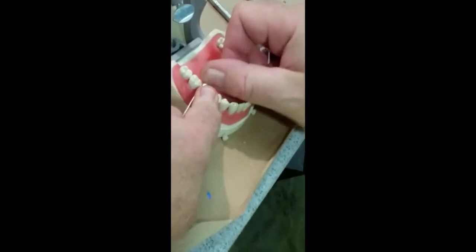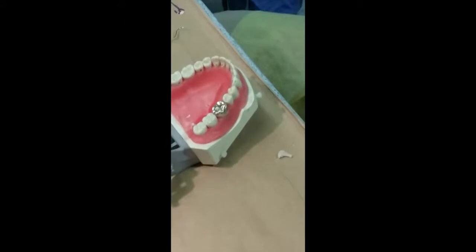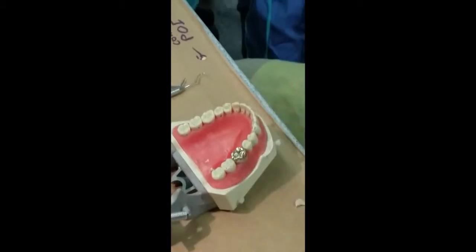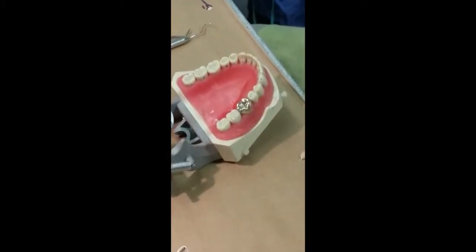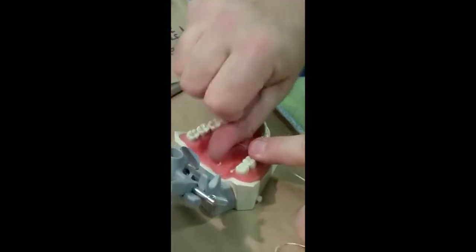Go through like this. Now, if you're shredding the floss, why is that? This actually feels a little looser on the mesial now and tighter on the distal. When we had the crown without any cement, it could give way a little bit when flossing. Now it doesn't. So it's a little loose on the mesial, a little tight on the distal. That's the sort of shift we're just going to have to accept — the patient will let you know if it's an issue. We had that die spacer in there; there was a little bit of give. All of that room is now taken up with cement.